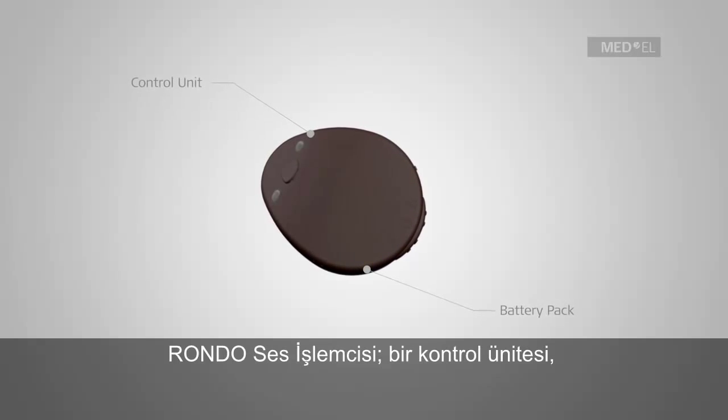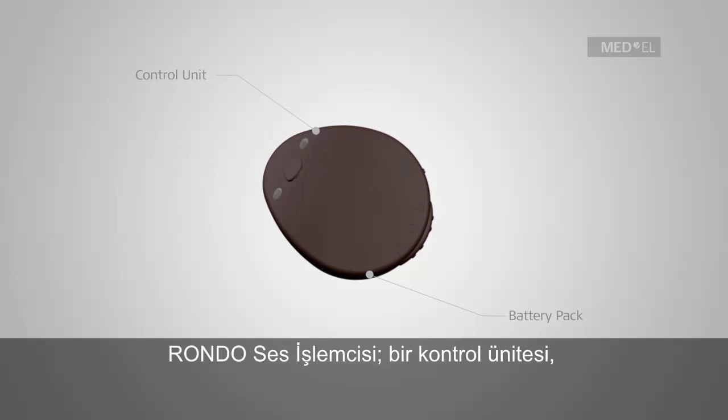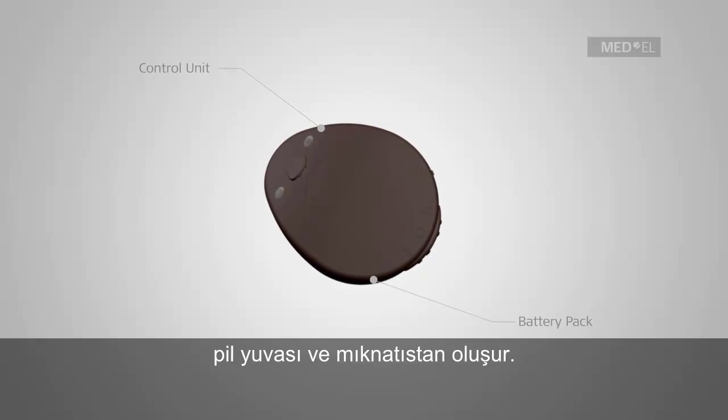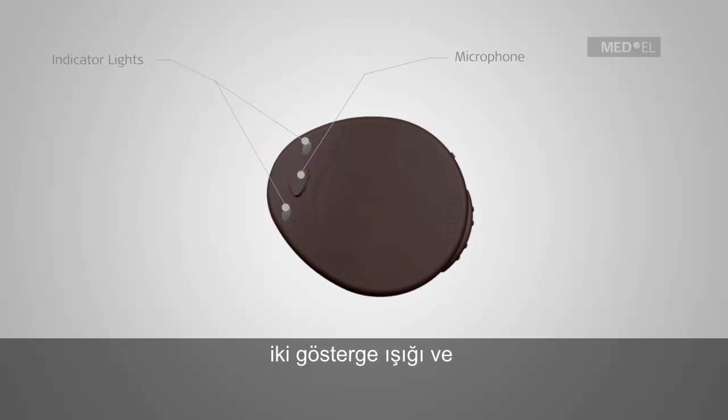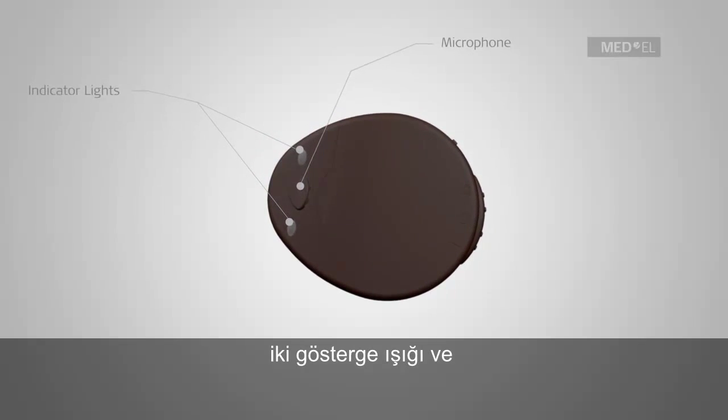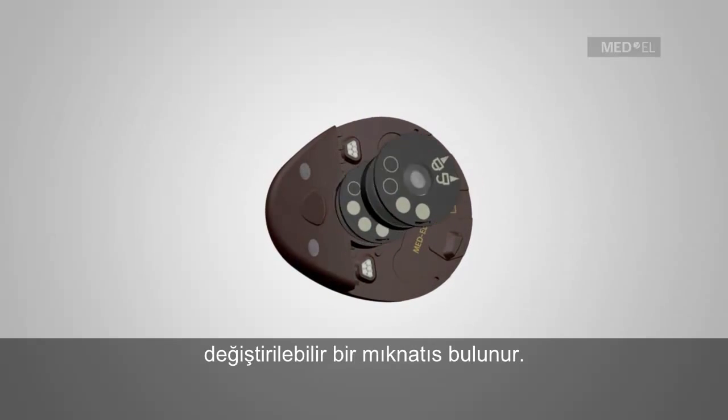The RONDO Audio Processor consists of a control unit, a battery pack, and a magnet. The control unit includes one microphone, two indicator lights, and a replaceable magnet.